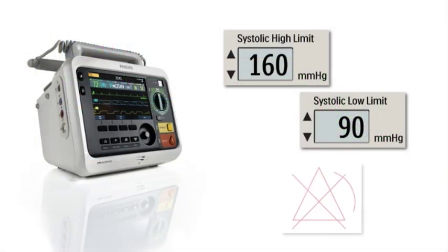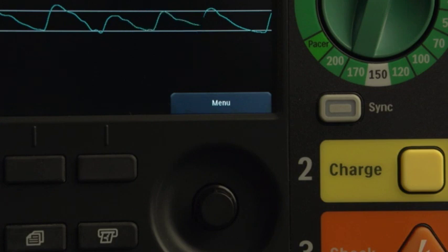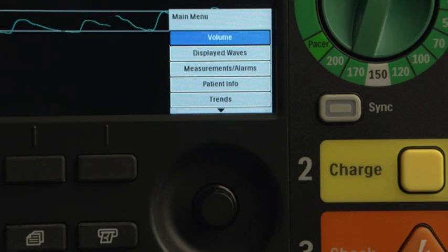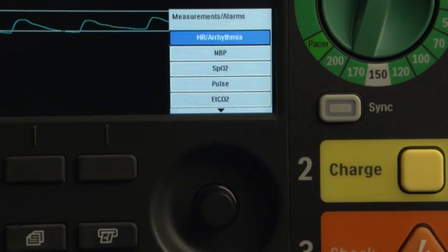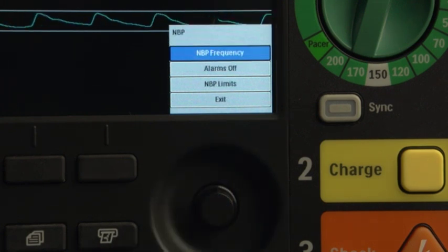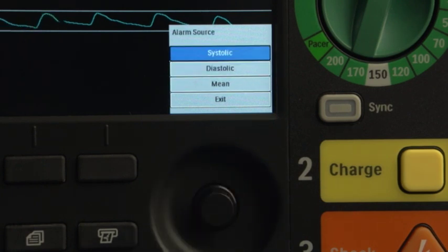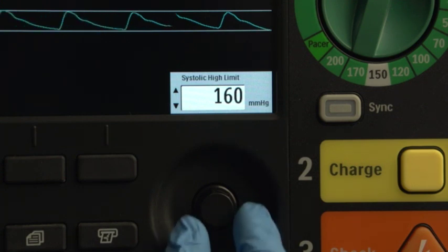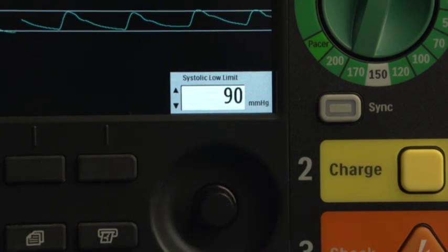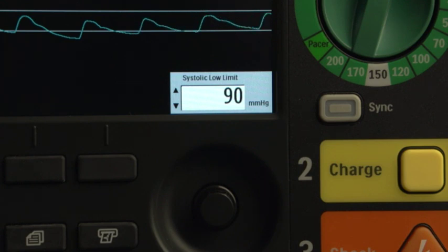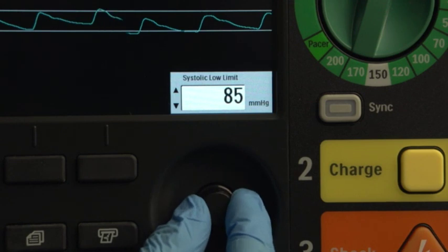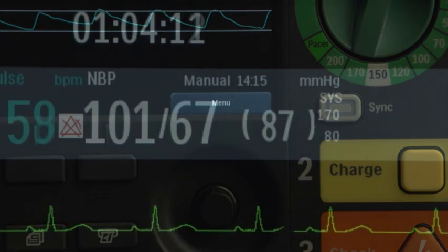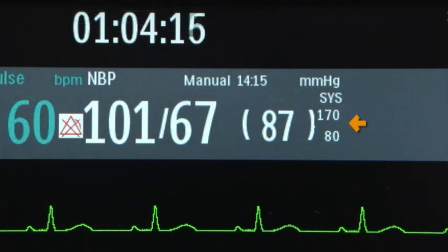Setting high and low alarm limits and turning alarms on or off is the same for all measurements, so let's look at how to do these tasks using NBP and SPO2 as examples. To set the high and low limits, press the Smart Select knob. Use the Smart Select knob to highlight and select measurements alarms, NBP, NBP limits, Systolic. The high limit appears in a window — use the Smart Select knob to increase or decrease the high limit and press it to set the new high limit. Then the low limit appears; use the Smart Select knob to adjust and press it to set the new low limit. The current high and low limits for each measurement appear next to its measurement numeric.